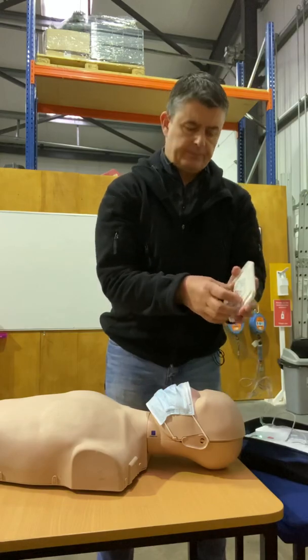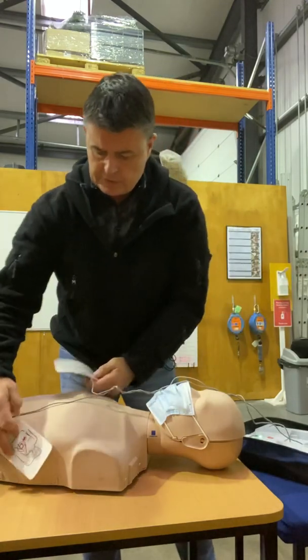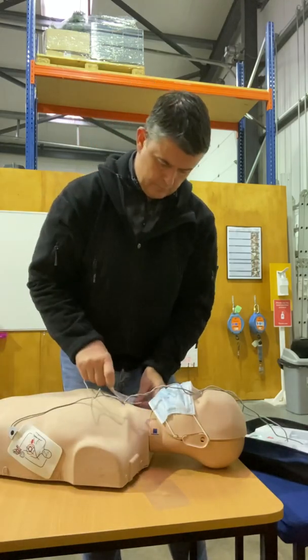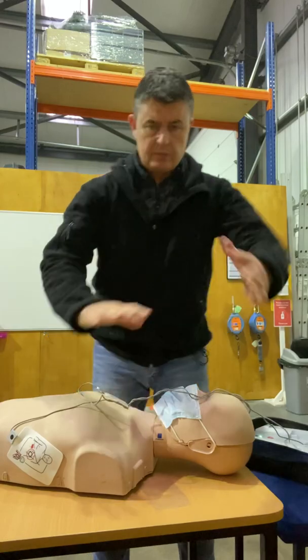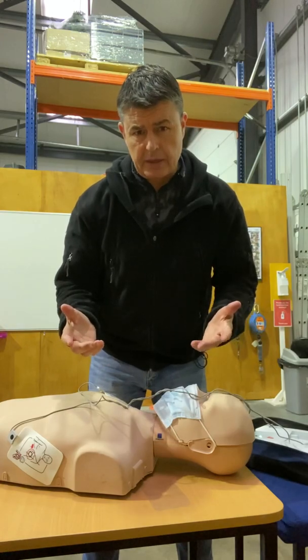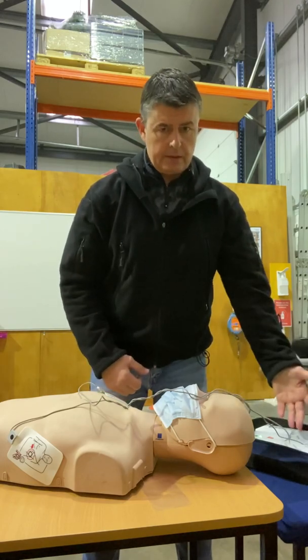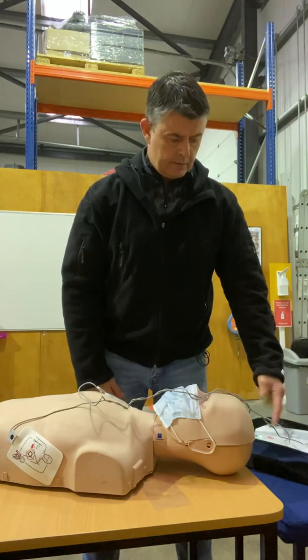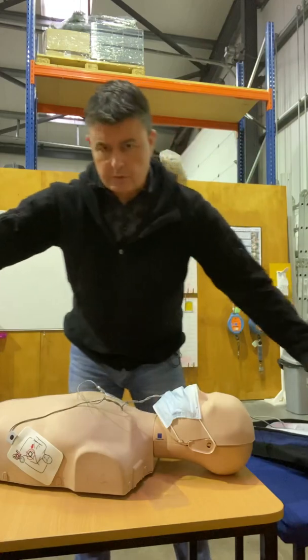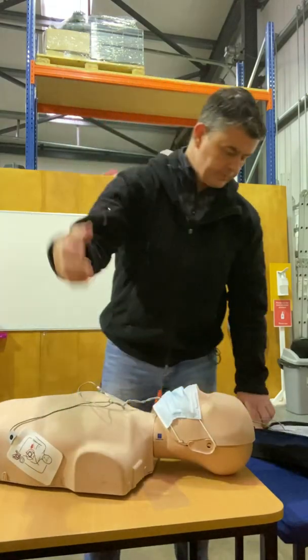Remove the pads, press the adult button — it tells you where they go on the chest. Remove clothing from the patient: one pad on the side, open the packet and apply the pad onto the patient, press firmly on skin; one pad up on top. You need to leave the patient — do not touch the patient. It's analyzing the heart rhythm and deciding whether it needs to shock the patient or not. Shock advised — do not touch the patient. It's charging the unit. Everyone clear — the light's going to flash, clear the patient, no one touching.